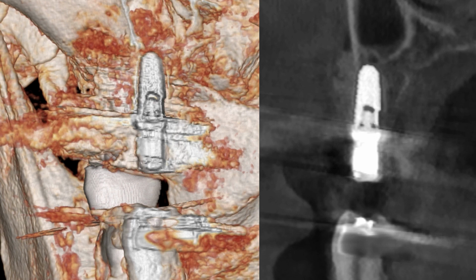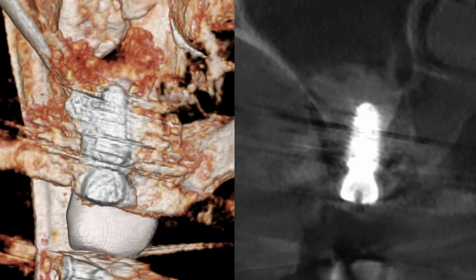This is the second bicuspid, or the first implant in the front. We can actually see the facial bone contour of the newly grafted sticky bone. This is the middle implant with a good rise on the apical end of the implant, representing a good 4 or 5 millimeters of bone beyond the apex, which is adequate and very, very promising.